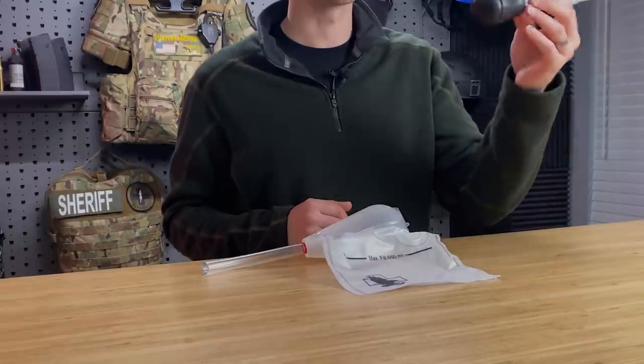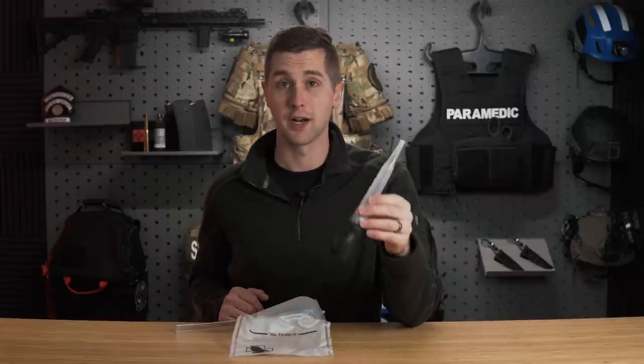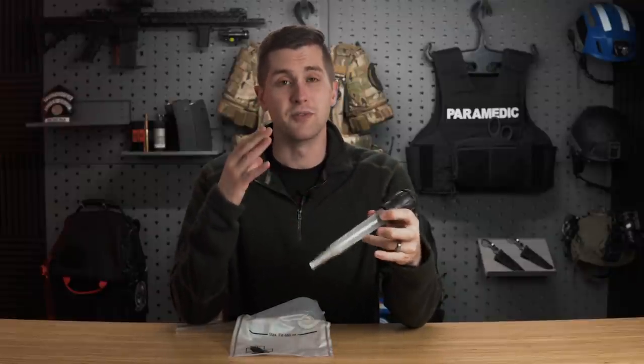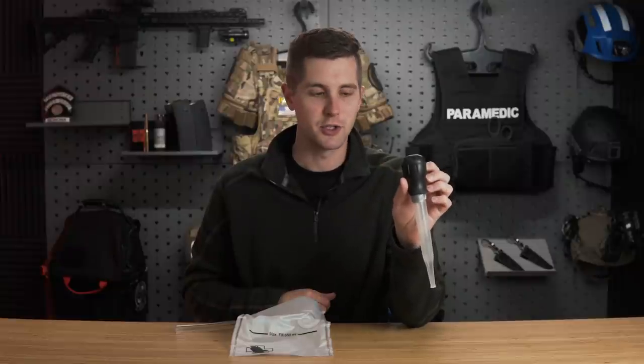The first device we're going to talk about is the turkey baster. I was originally taught how to do suction with this in my outdoor emergency care class for ski patrol and I carried one in my pack. However, the reality is you really should not be using one of these for suction — they do not work very well at all. Number one, the tip is really small and it doesn't get a lot of big chunks. Number two, you just don't have a lot of ability to get large volumes out of the patient's airway. In my opinion, you'd be far better served rolling the patient on their side and doing a visualized finger sweep. I would not recommend a turkey baster.